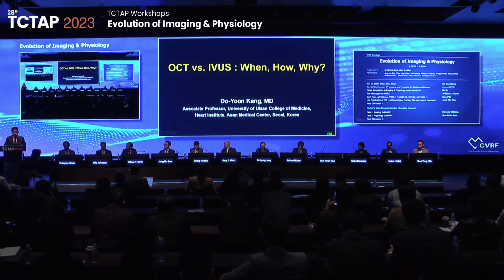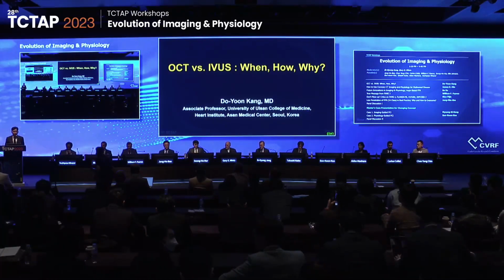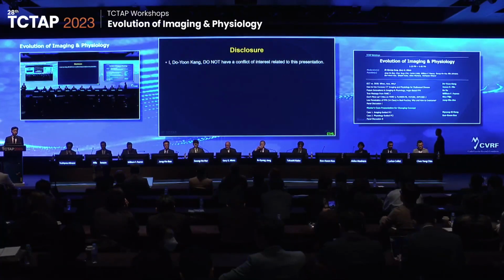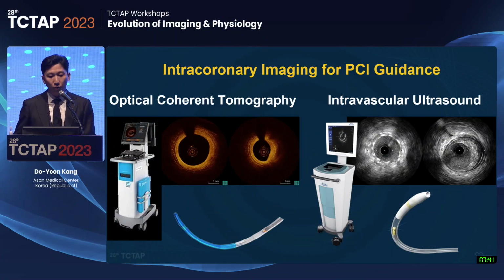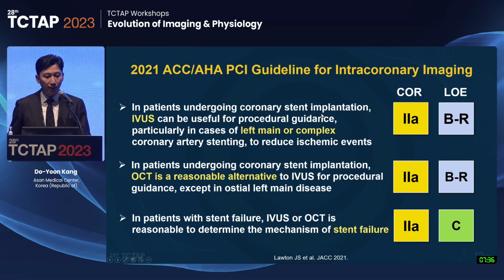Thank you for your introduction. I'm Dr. Kang from Asan Medical Center. I will talk about OCT versus IVUS for PCI guidance. We have two major intracoronary imaging devices. One is OCT, and two is intravascular ultrasound.